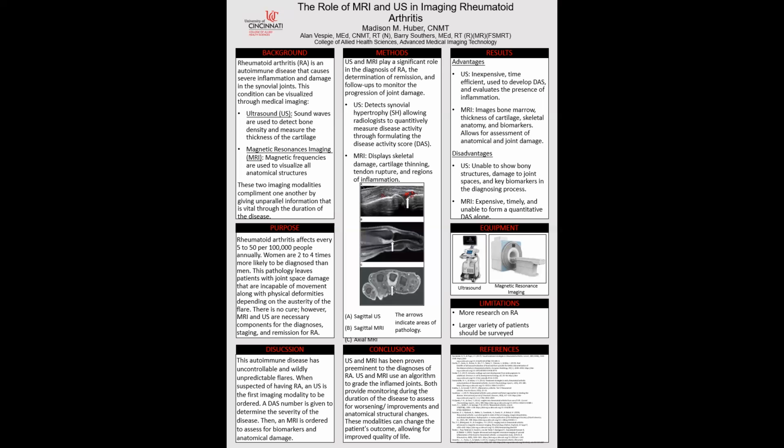In conclusion, ultrasound and MRI have proven paramount in the diagnosing process of this disease. Ultrasound gives an algorithm to help grade the inflammation of the joint space, and MRI visualizes biomarkers. Both of these modalities are necessary in the diagnosing process of this pathology.